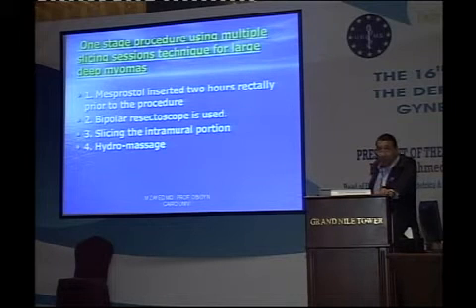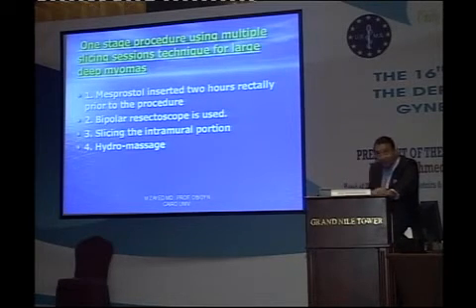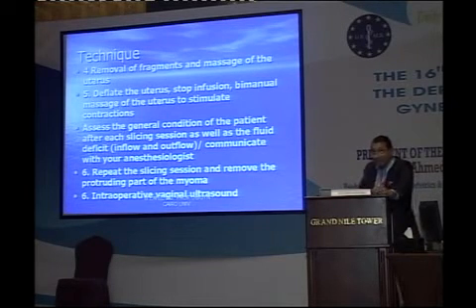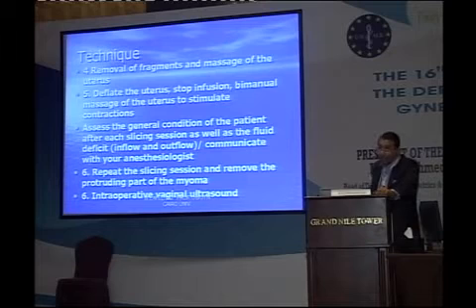And then when you finish with that, you will do a pelvic hydromassage, which means that we're going to deflate the uterus. And when we deflate the uterus, this will help the contraction of the uterus. You inject a little bit of saline again, so you inflate and deflate. This kind of hydromassage will definitely help to contract the uterus and push the intramural part of the fibroid within the cavity.